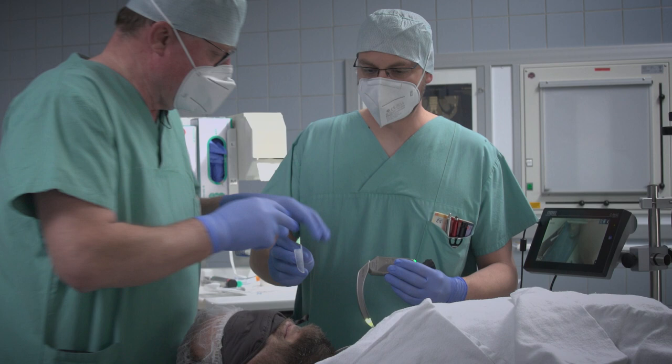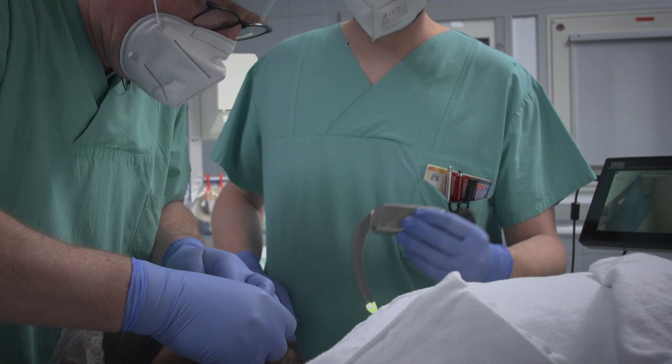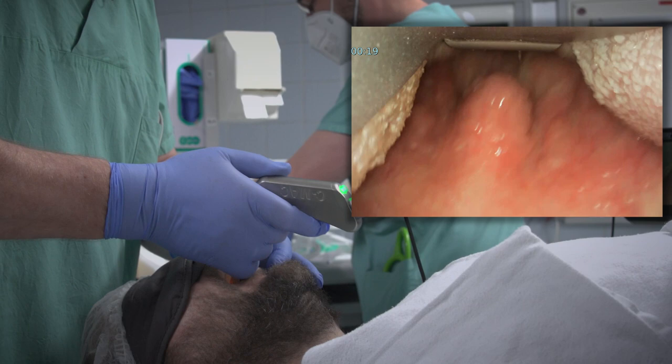What are the steps when we do an intubation? First of all, we need to prepare the patient properly, which means every patient gets a teeth protection. You can see I have already inserted the teeth protection.